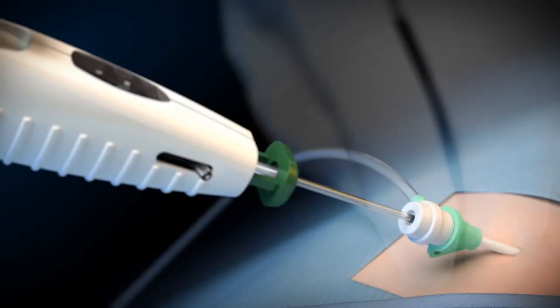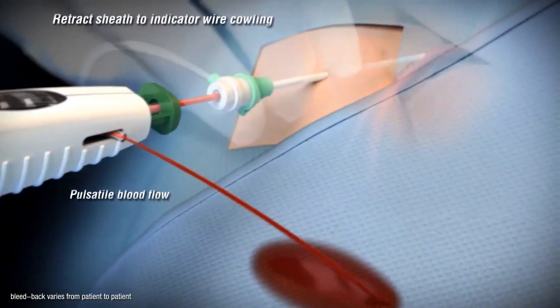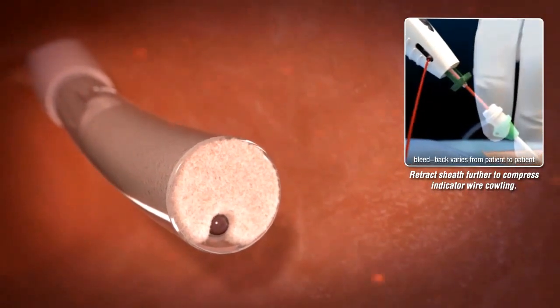Without advancing the device, retract the sheath to the indicator wire cowling. You will note pulsatile blood flow from the bleed back indicator. The pulsatile blood flow indicates that the device has been positioned properly. Continue to retract the sheath to compress the indicator wire cowling.